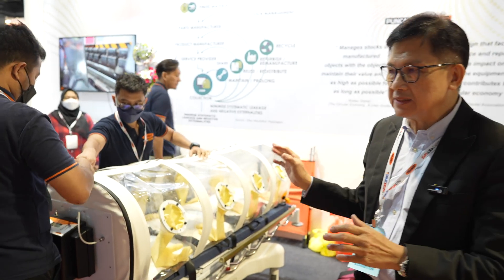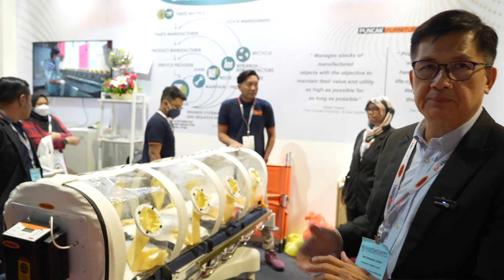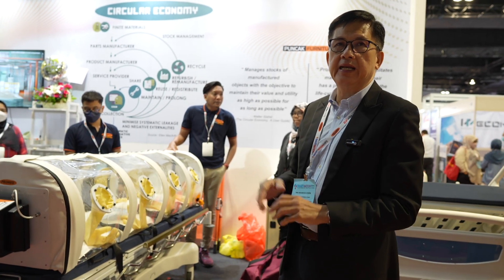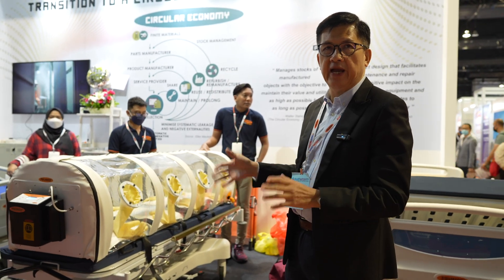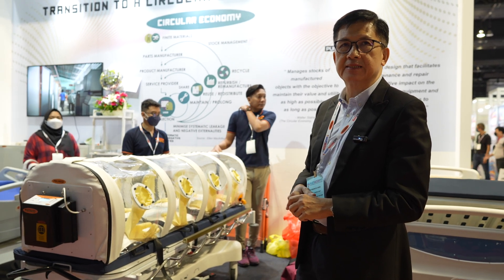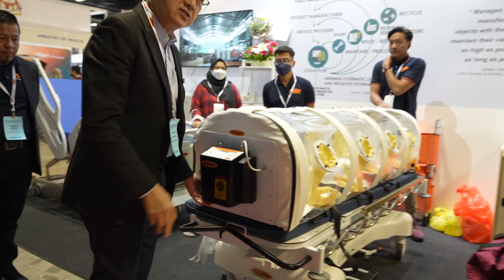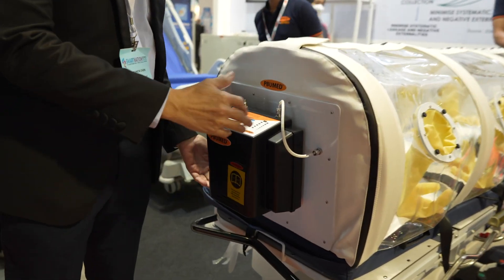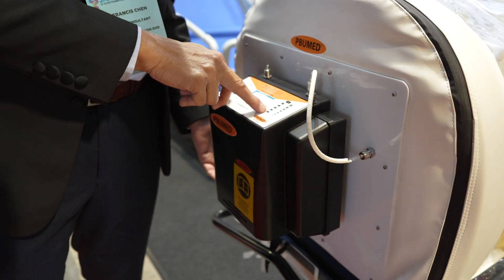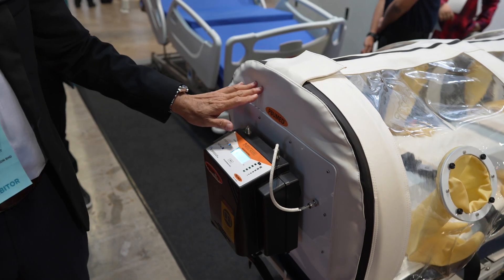It is also safe for the user taking care of the patient, and it is suitable for transportation in any place. Even in a normal van you can use this — you don't need a negative pressure ambulance. The unit runs on a lithium battery with 8 hours of durability, and there is a battery indicator and a manometer tube to check the pressure inside.